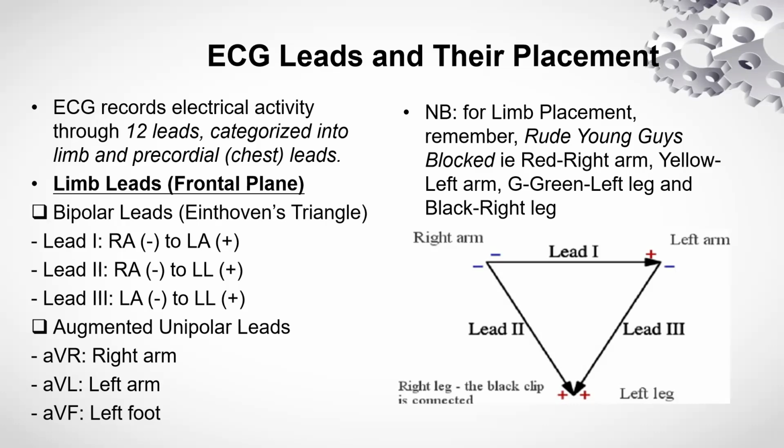But sometimes we need to insist on the 12 lead ECG, especially for patients that we need to monitor, patients with a history of arrhythmias, life-threatening arrhythmias, or patients who have had cardiac surgeries and all that. So the 12 lead ECG is important. That's what we're going to consider here.